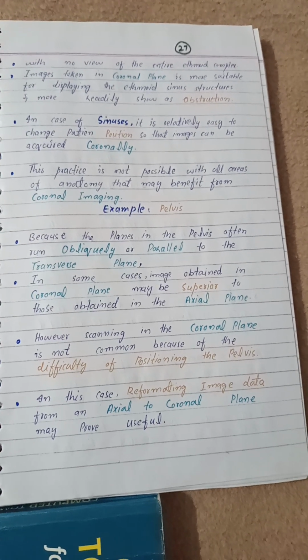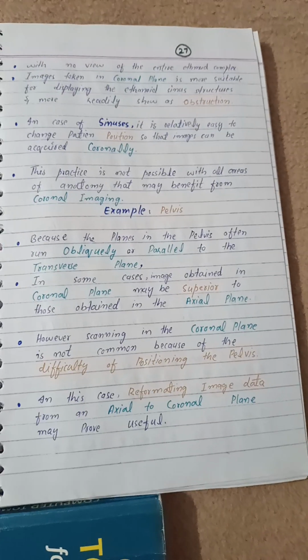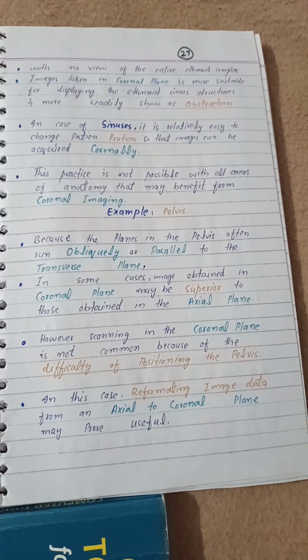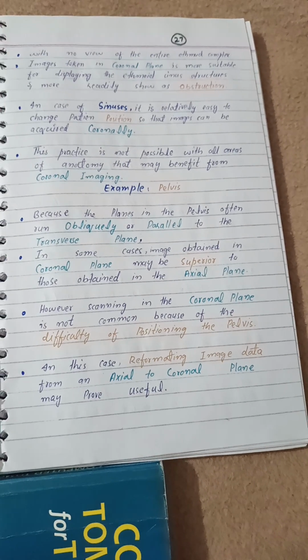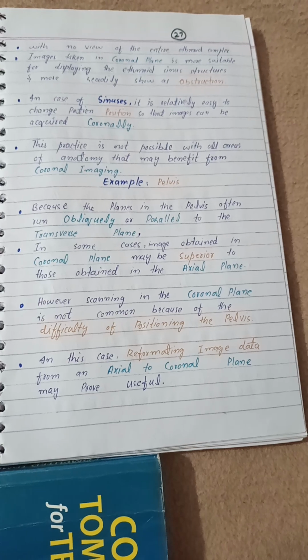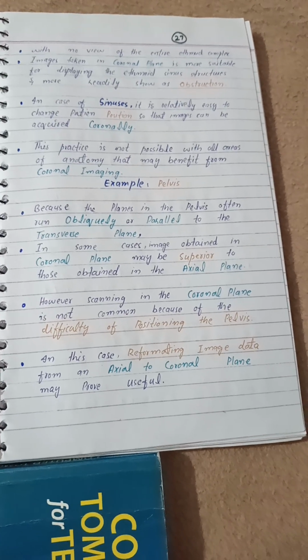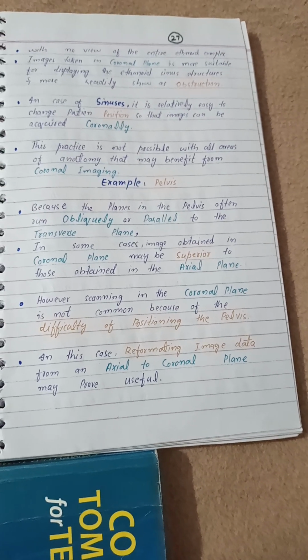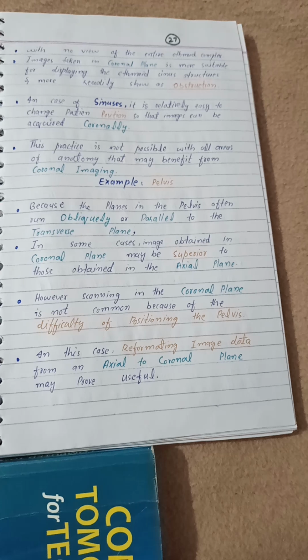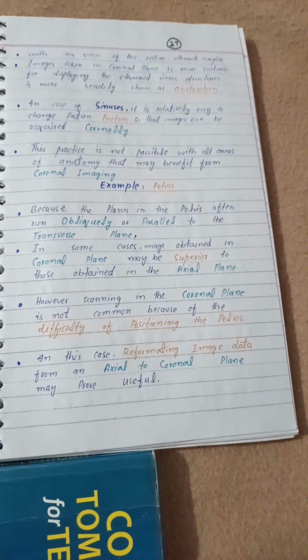This practice is not possible with all areas of anatomy that may benefit from coronal imaging. For example, the pelvis. Because the planes in the pelvis often run obliquely or parallel to the transverse plane, in some cases images obtained in the coronal plane may be superior to those obtained in the axial plane. However, scanning in the coronal plane is not common because of the difficulty of positioning the pelvis. In this case, reformatting image data from an axial to a coronal plane may prove useful.